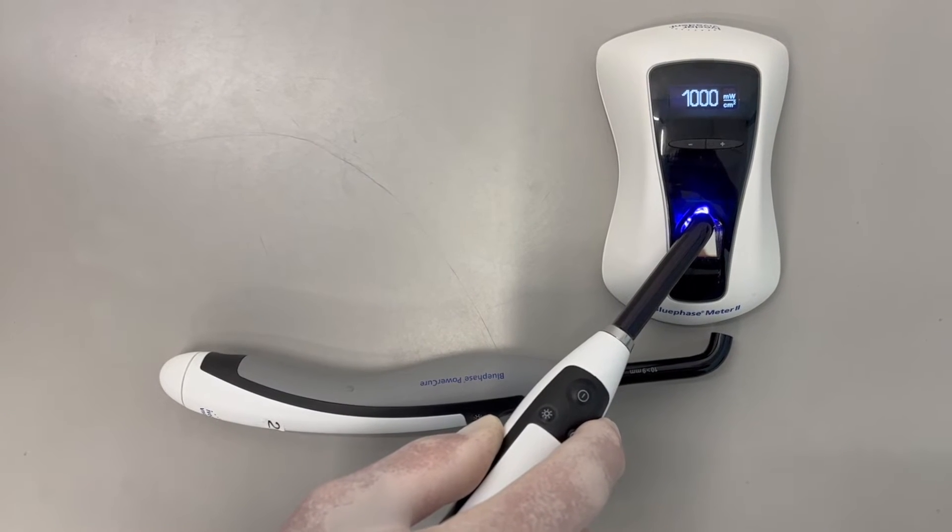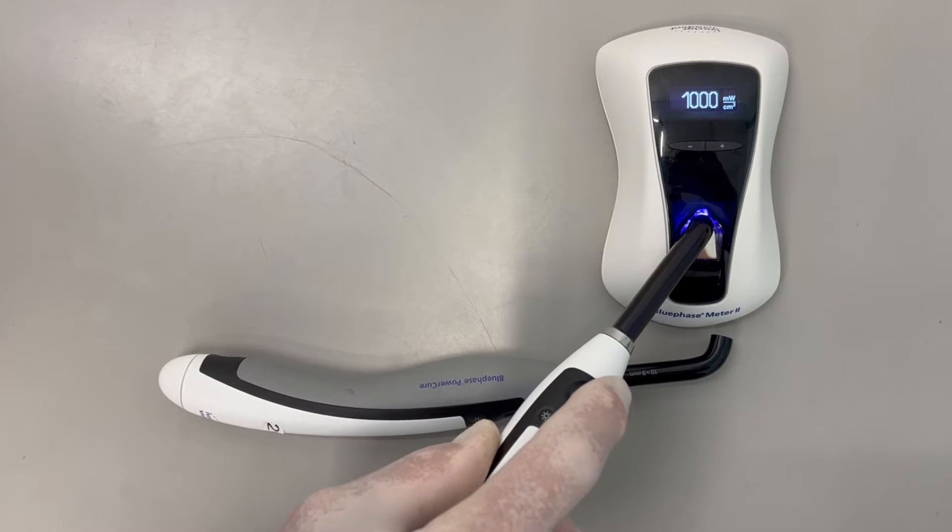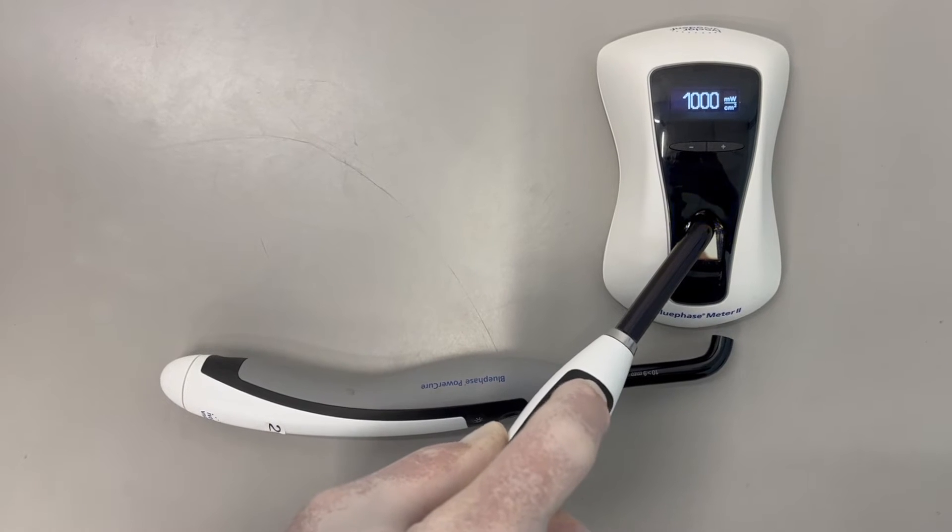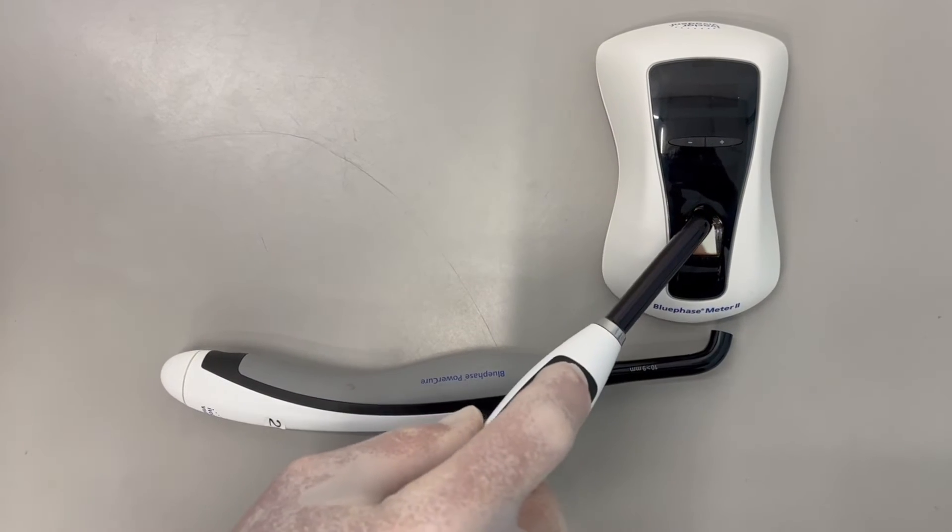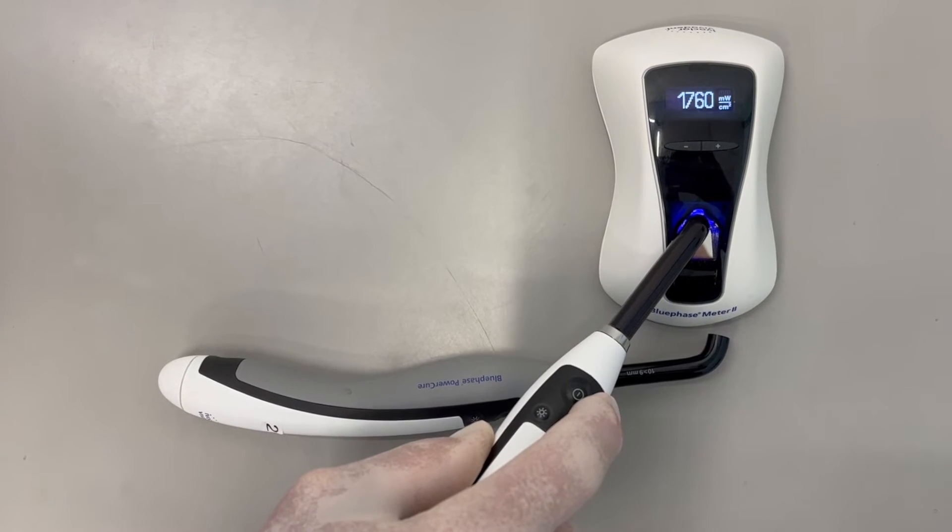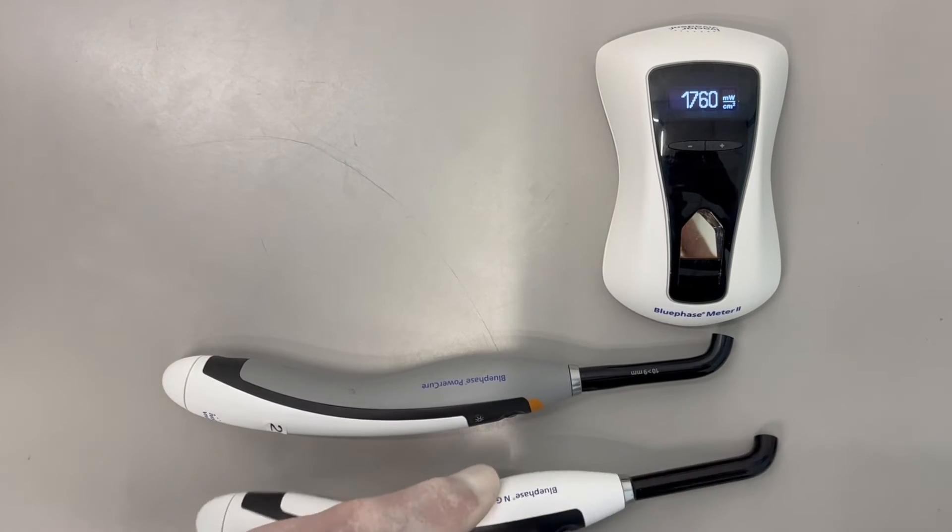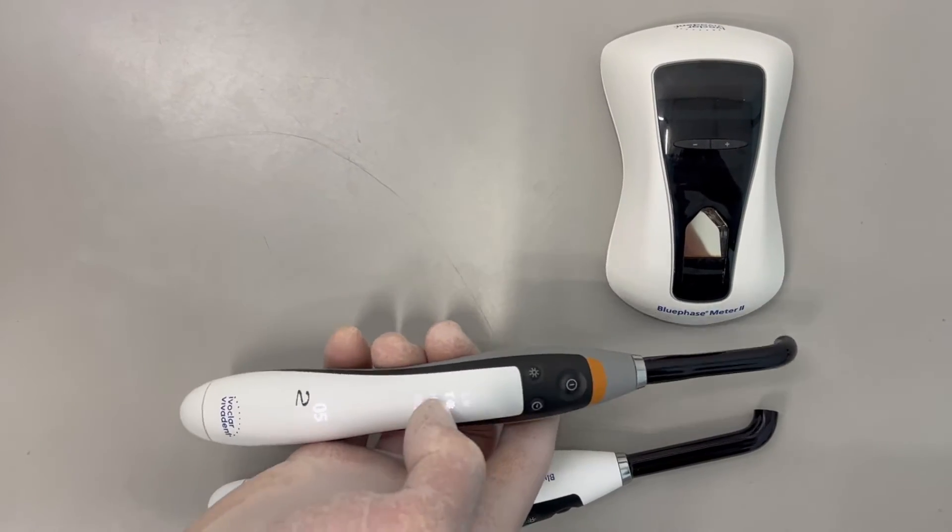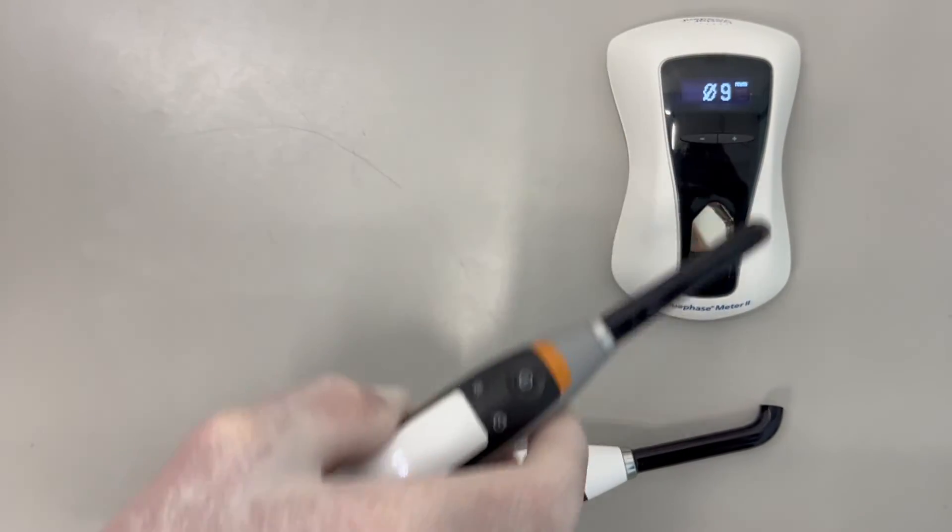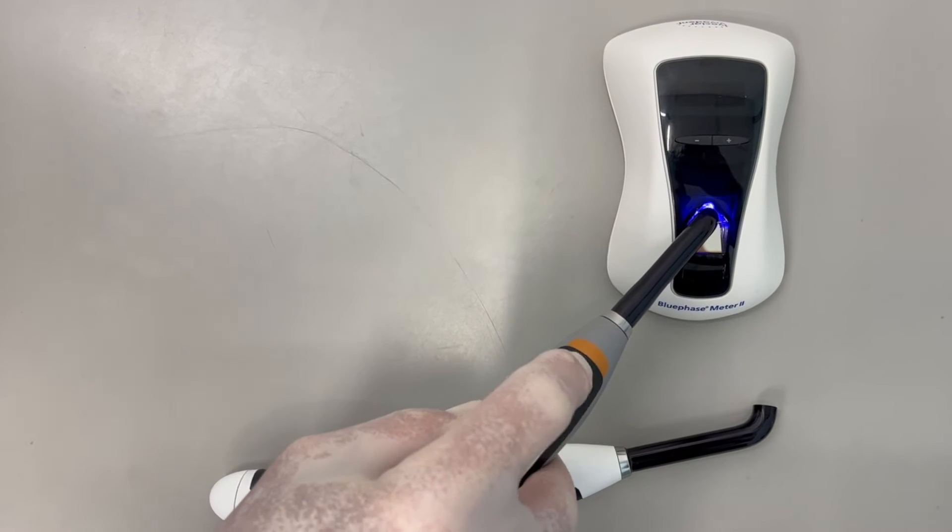Both lights deliver the same irradiance on the high setting. Now changing to the turbo setting: the NG4 delivers 1760, and when we change the tip diameter to 9mm for the PowerCure, the output is 1750 milliwatts per centimeter squared.